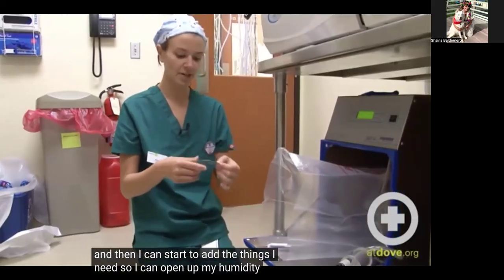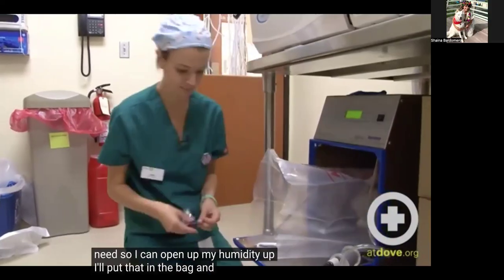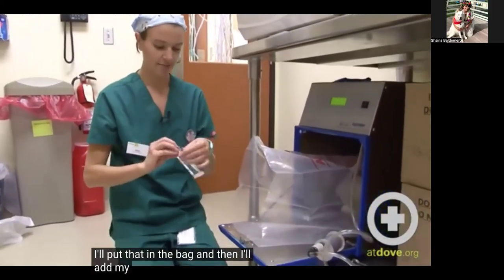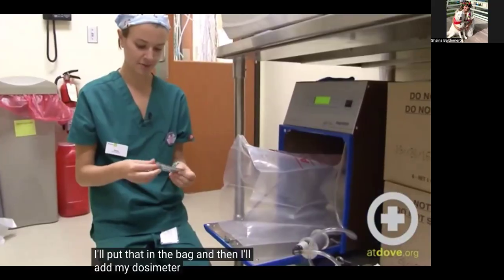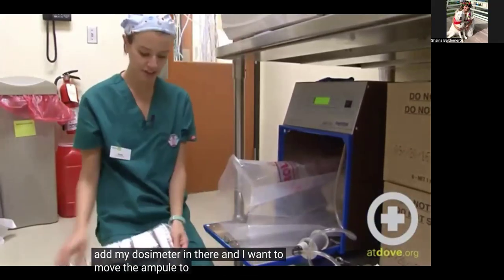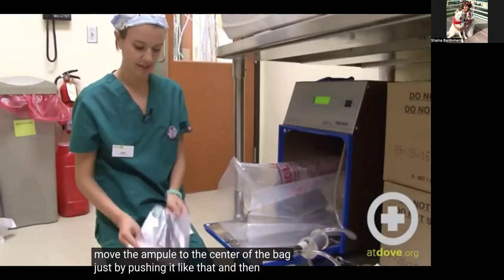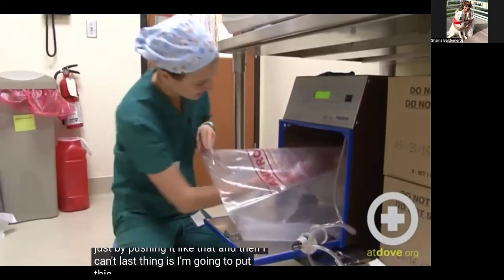So I can open up my humidity chip. And I'll put that in the bag. And then I'll add my dosimeter. I'll put that in there. I want to move the ampule to the center of the bag just by pushing it like that. And then last thing is I'm going to put this in the bag.